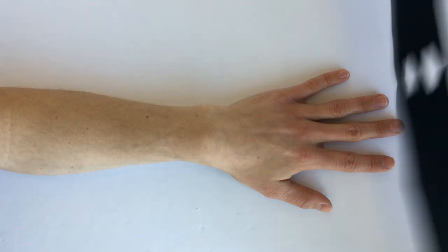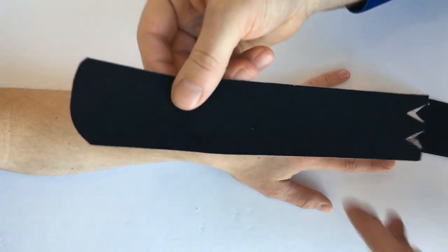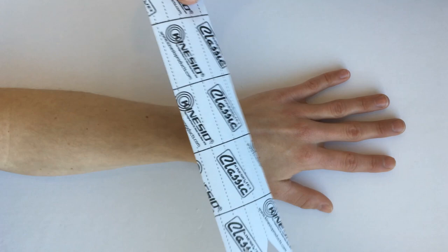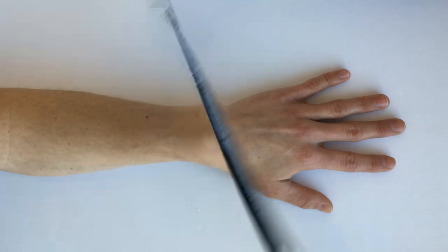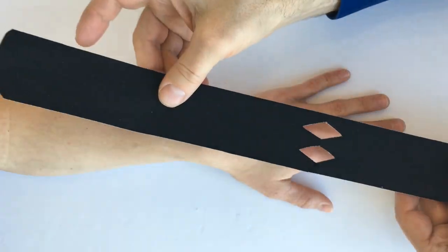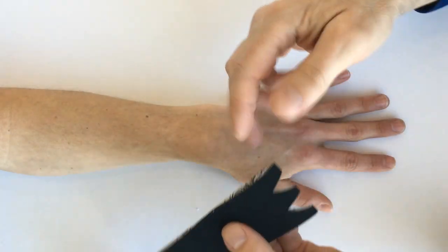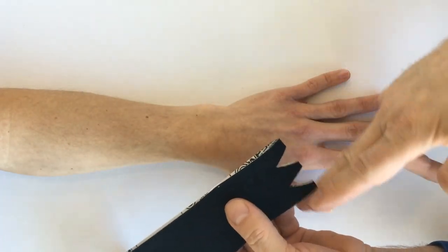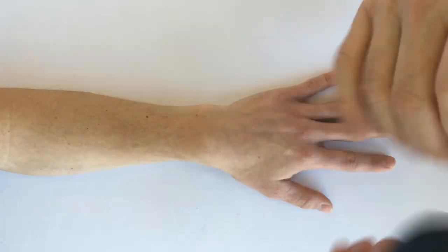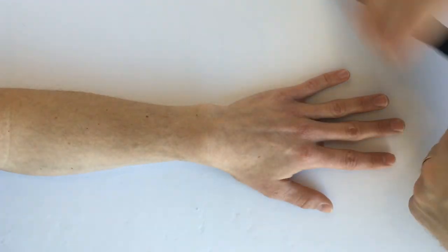One simple way to use kinesio tape for this is to have a strip about 20 inches long. I fold it over in the middle, then with my scissors, cut a couple of diamonds out, and then I have my strip of kinesio tape.